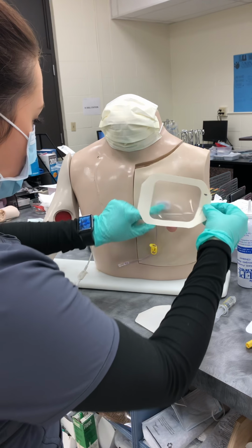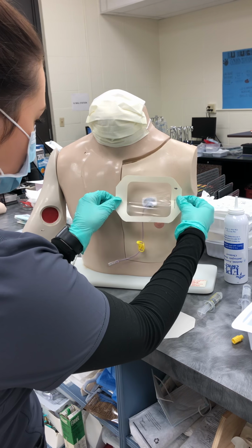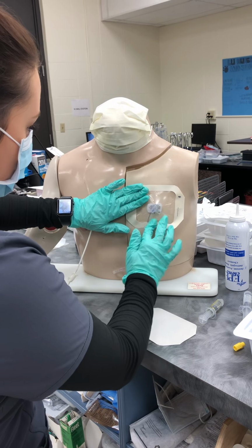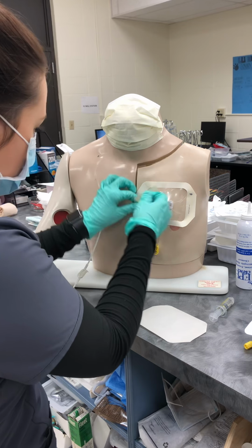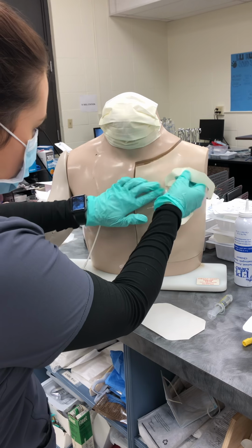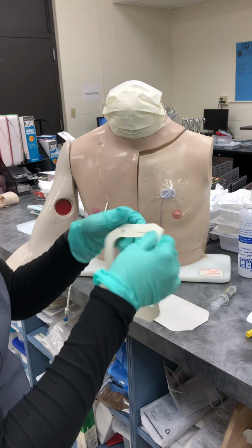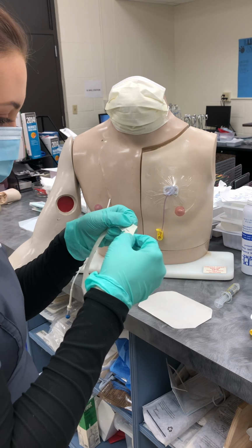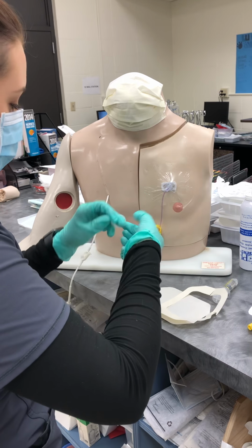Make sure our needle is secure, and we're going to apply that over the top, and then you'll remove this just like that, and then move this little sticker and write the date and time and your initials of when it was placed.